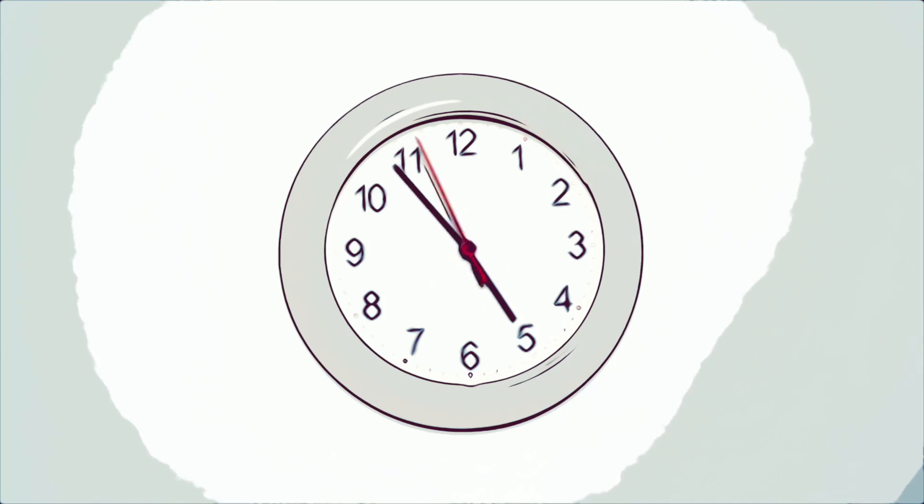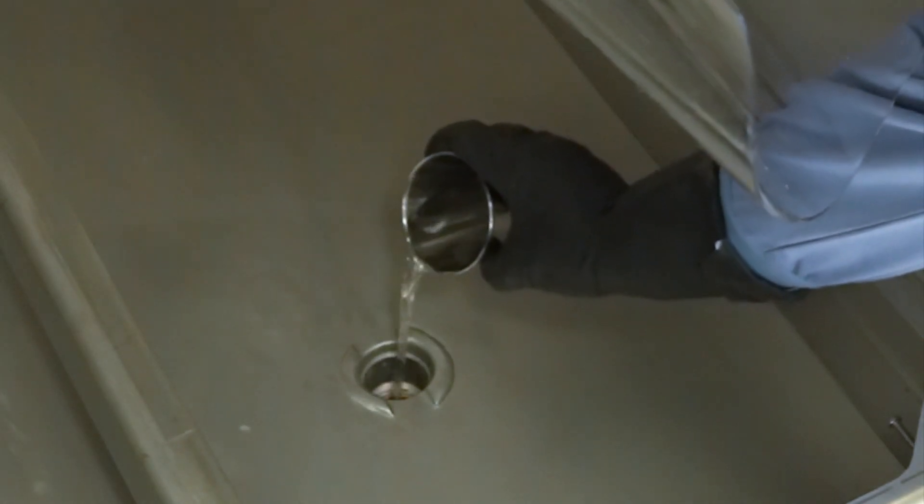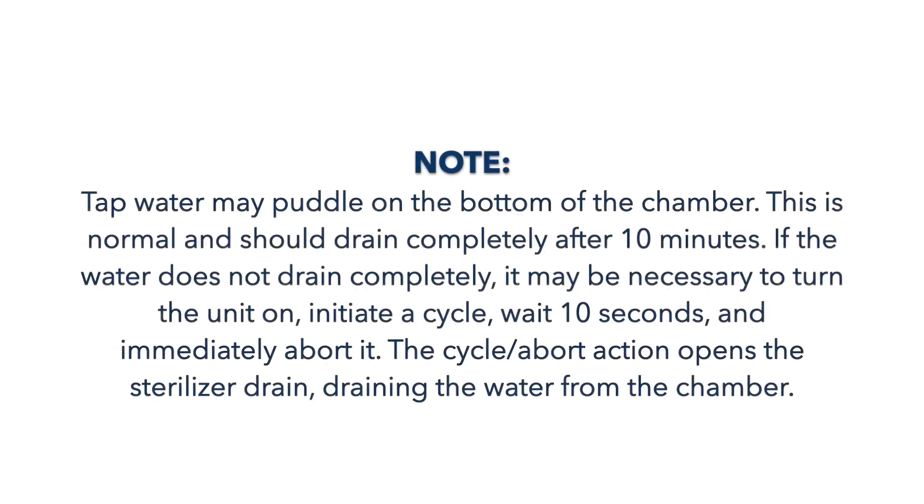Step 5: After 5 minutes, pour approximately 1 pint of hot tap water down the drain to rinse out the Prolistica HP Neutral Manual Cleaner. Note: the tap water may puddle on the bottom of the chamber. This is normal and should drain completely after a few minutes. If the water does not drain completely, it may be necessary to initiate a cycle and immediately abort it. The cycle abort action opens the sterilizer drain, draining the water from the chamber.